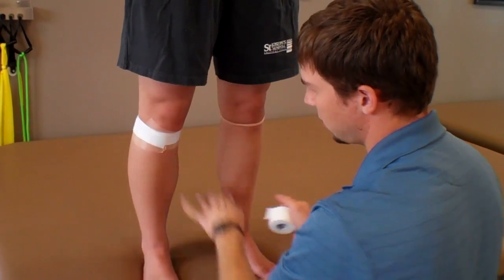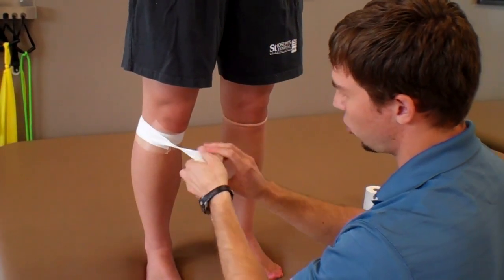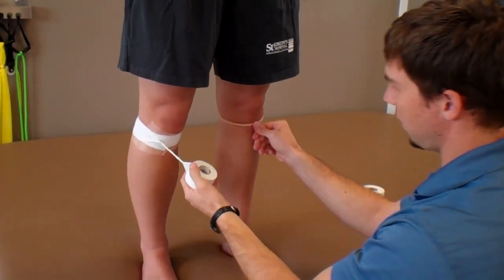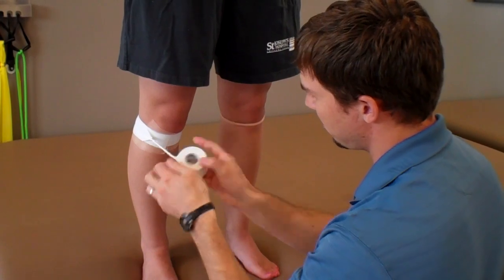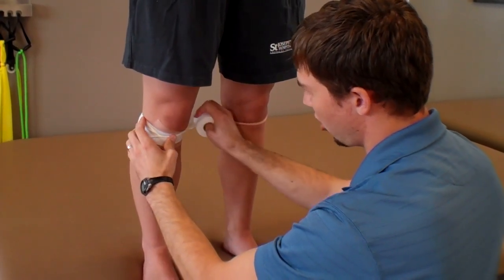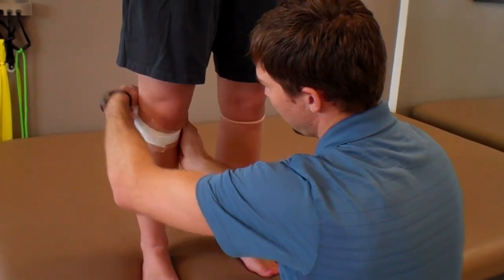We're going to stop each time to make sure we don't get too tight. Next one, you're going to start behind again, and we're going to start a twist. This is going to serve as the same thing as the other side for that Cho-Pat. Starting there, you're going to put a little bit of pressure into it, and then finish around the back.